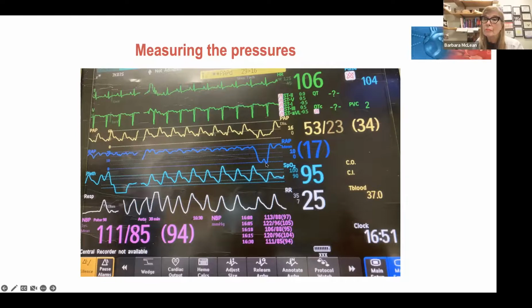But if I'm reading this as your exhalation time, your pressure is 0, which would mean you've got to have volume. Now, the problem is this is actually a patient who is on APRV. APRV just means we have a constant high pressure that opens the alveoli, like a high CPAP at around 25 to 30, and the right ventricle has to overcome that. The right ventricle is a little weak guy, and he can't really overcome it. Here you see it says RA because it's the PA catheter, so it's RA pressure. If this is the true RA pressure, your patient needs Flolan.